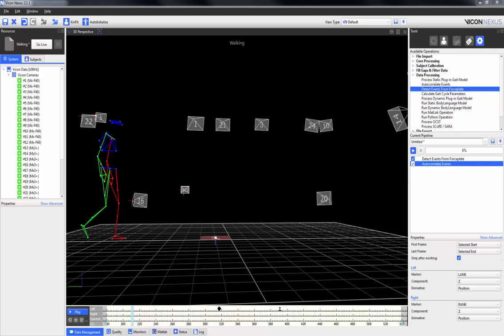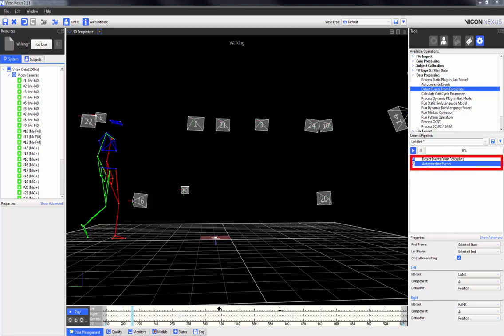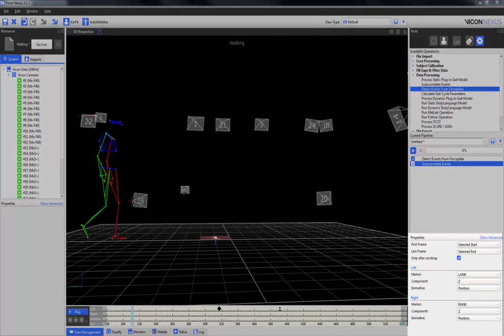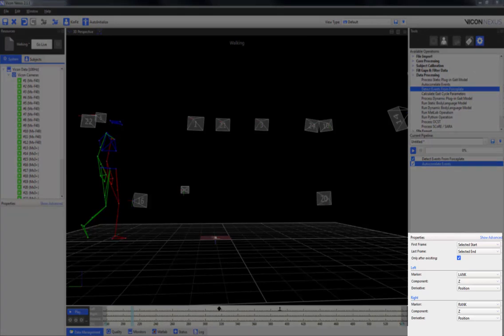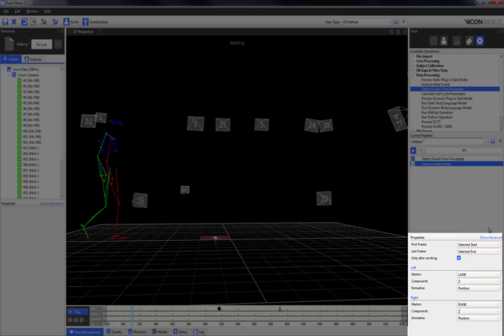Once event markers have been placed in the time bar either manually or through the Detect Events from Force Plate operation, the Auto-Correlate Events pipeline operation can be used to correlate the remaining gait cycle events. You are able to alter the marker that is used, and you can also select whether it is the X, Y, or Z component that you want to use.